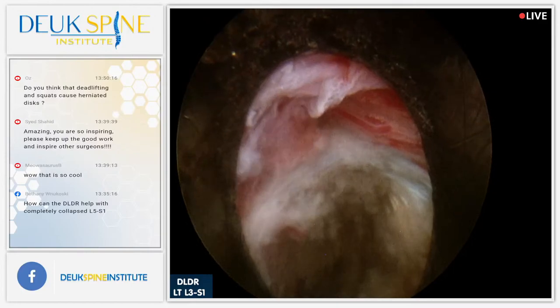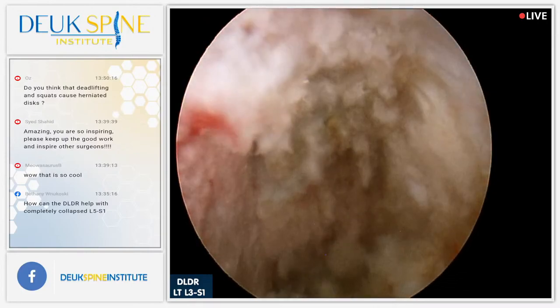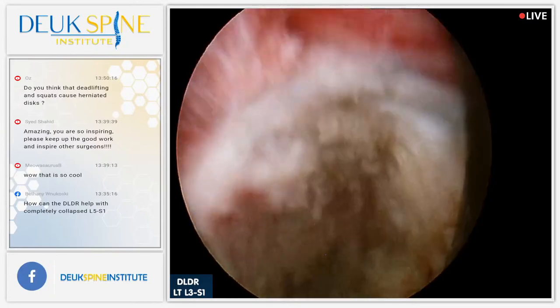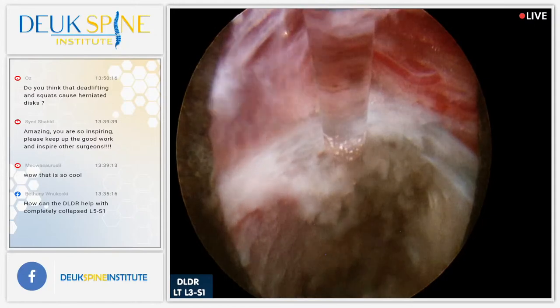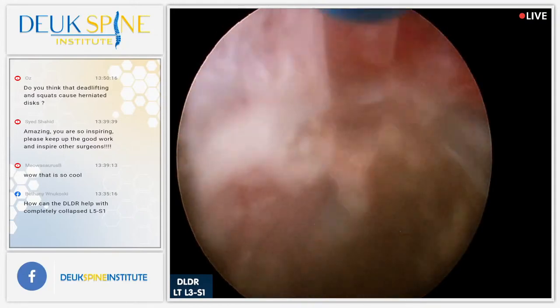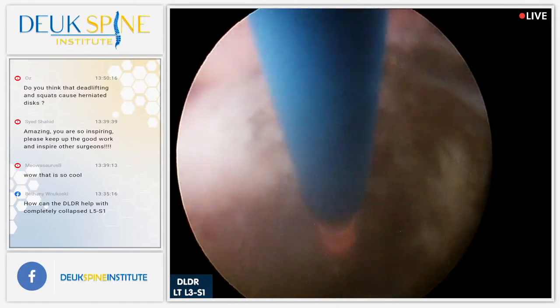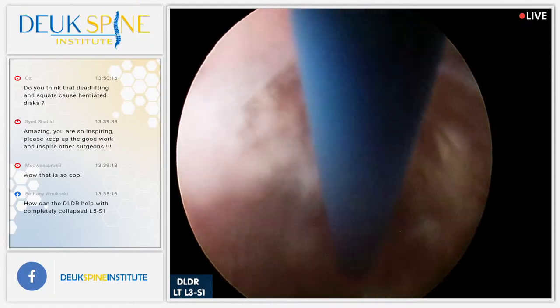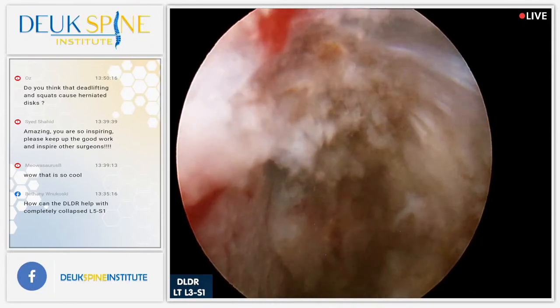Yeah, that looks good. Lights on. See the little veins there? Let me zap that one little area right there. Sorry. Laser. All right, pretty much done. Nice, complete.